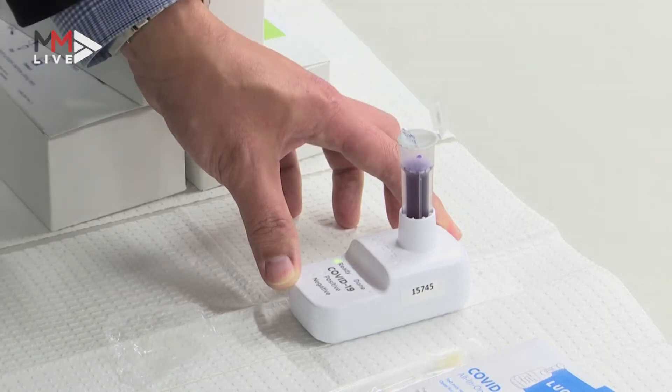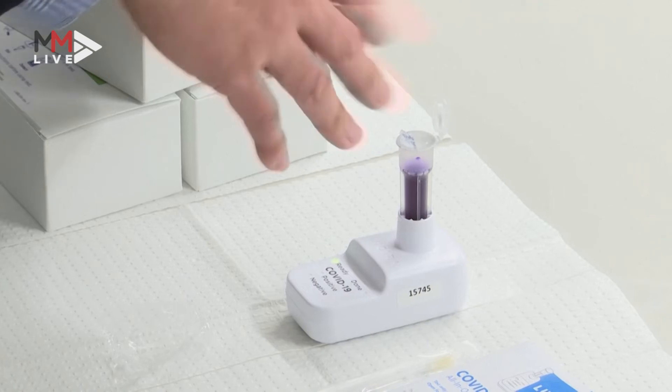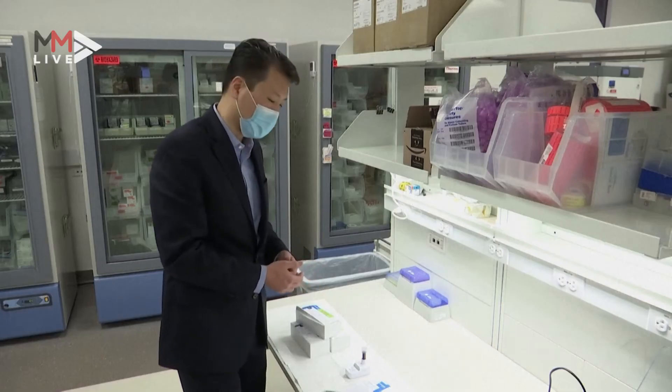Close the cap, and then push the whole thing down, which will engage the process of testing — and that gets the test started.